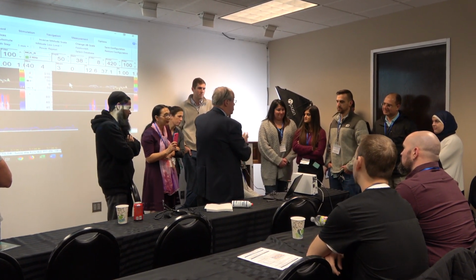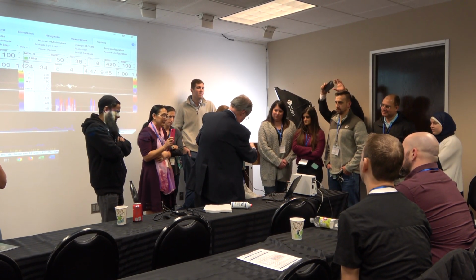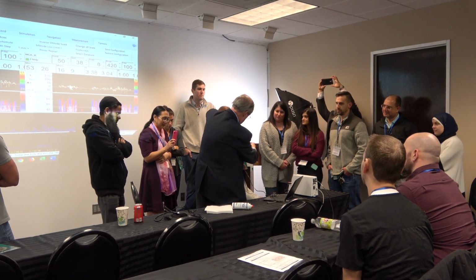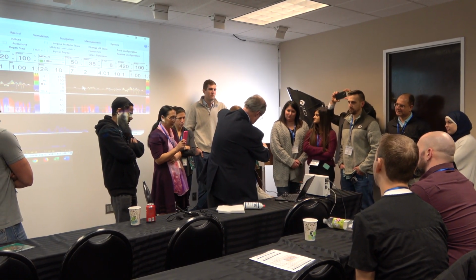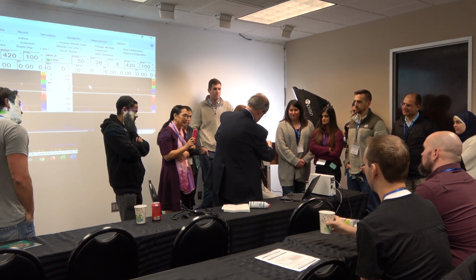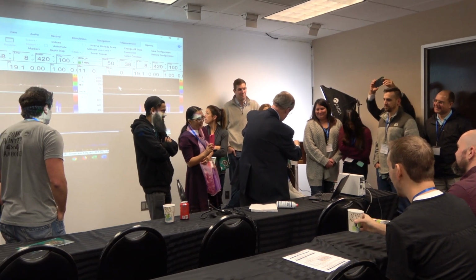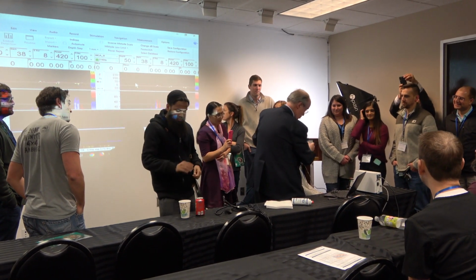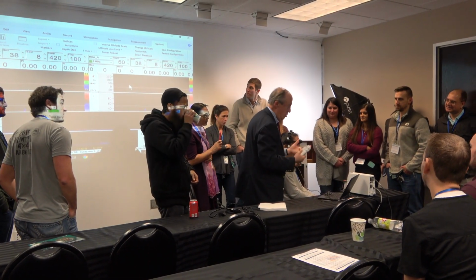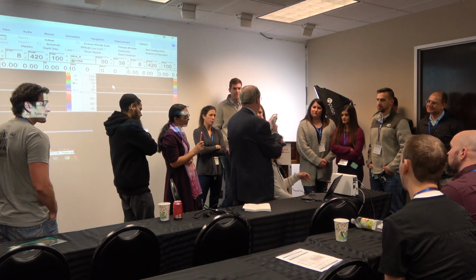Here we have knobs so we can adjust, right? So I'll put some gel now. And of course, if you are in the OR or inpatient, outpatient, gloves, right?